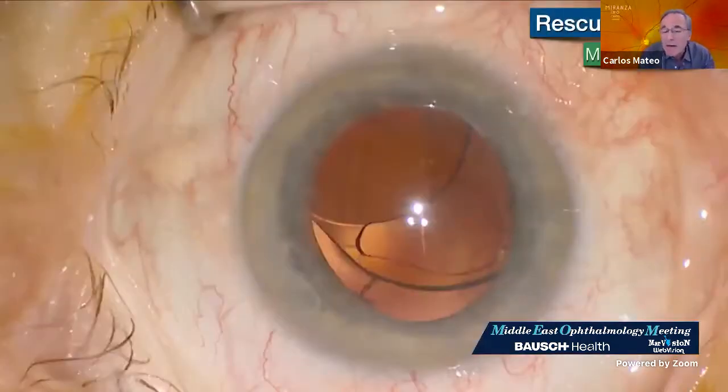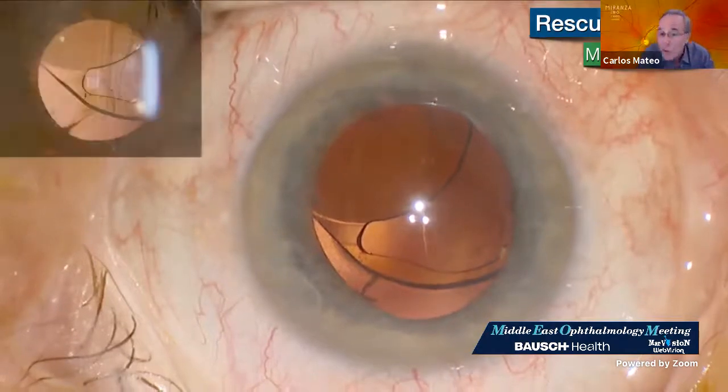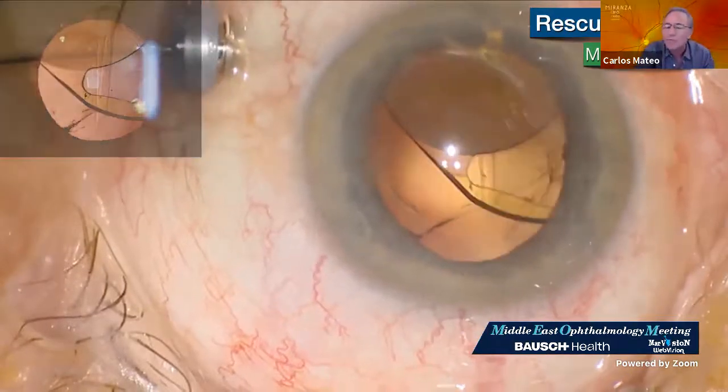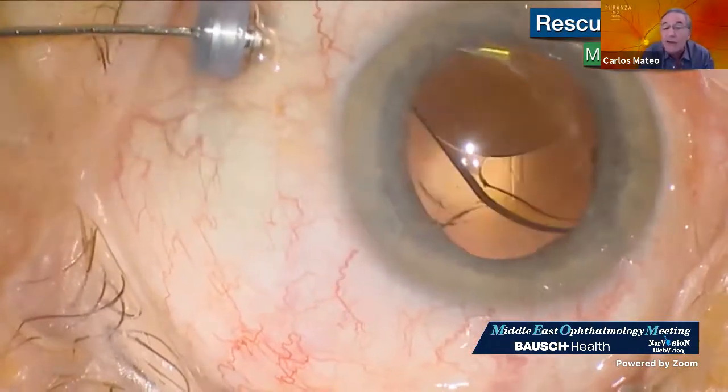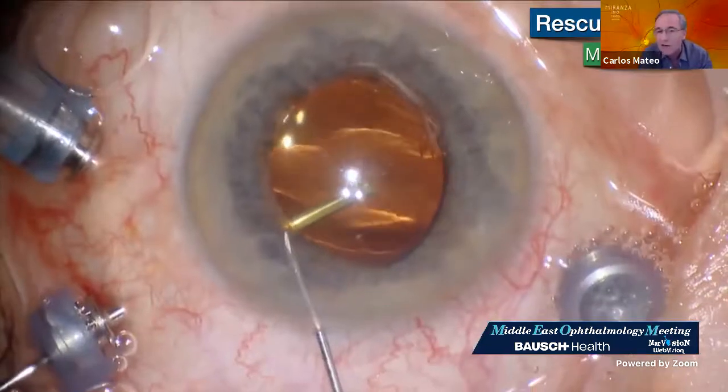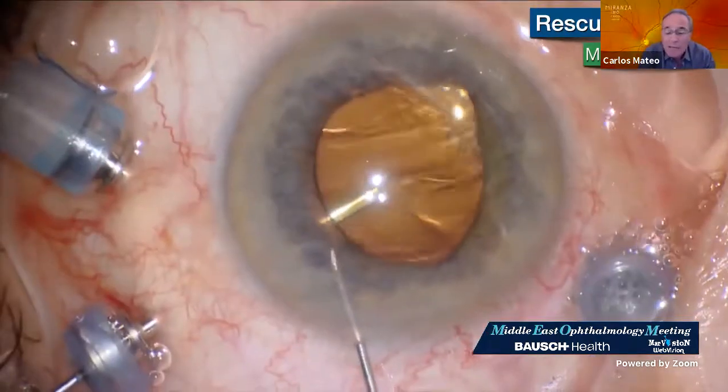Even if you have a multifocal IOL, 1 week ago I was discussing this topic with anterior segment surgeons. They were already familiar with multifocal IOLs. And even these lenses you can suture, in a case with very bad capsular support. I decided to suture this lens to the posterior surface of the iris using 2 sutures. The centration is very good.